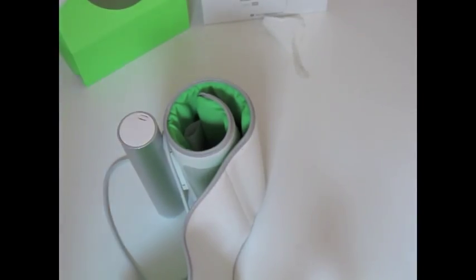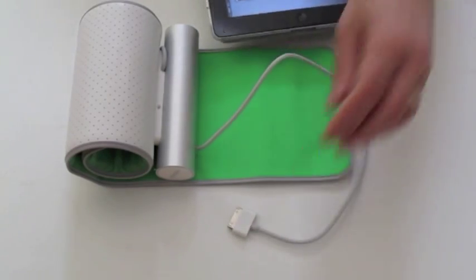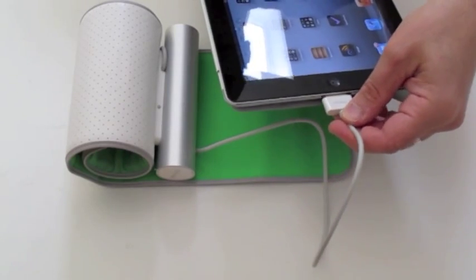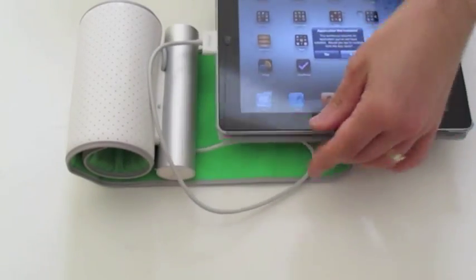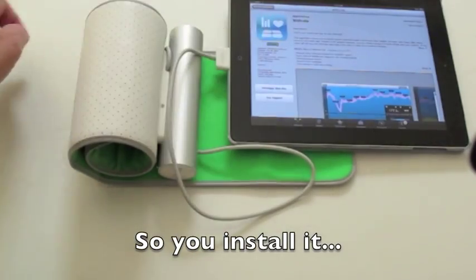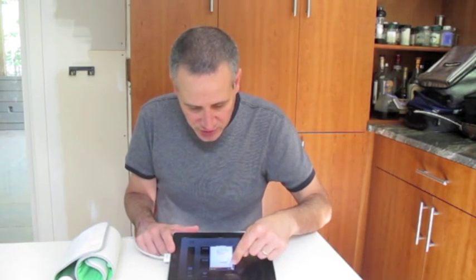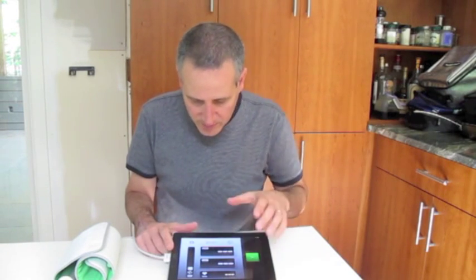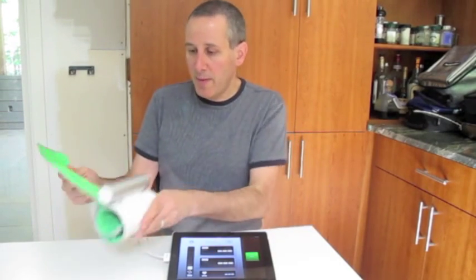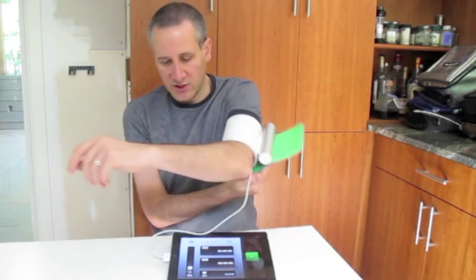The blood pressure cuff goes around the arm, obviously. Let's just fire it up. I've actually not used this yet, but what I read was that you take the iPad and plug in the blood pressure monitor, which we're doing right now. It gives an indication that the app is not installed. The iPad app is now installed, the account is created. When you unlock the iPad, you get some instructions — it tells you how to do things. Now it's showing my name and information. So I'm going to take the blood pressure cuff, put it on my arm like so, rest my arm, and then hit start.